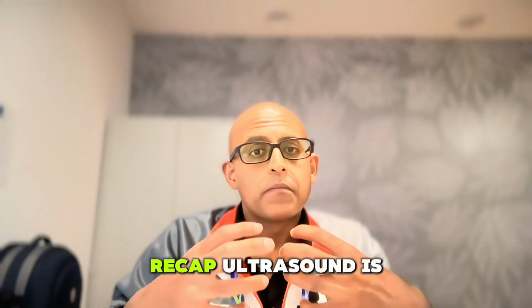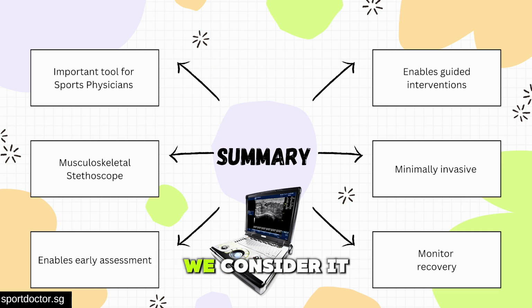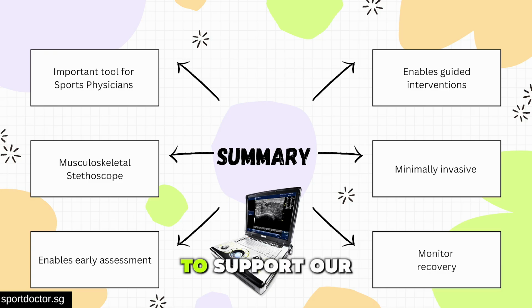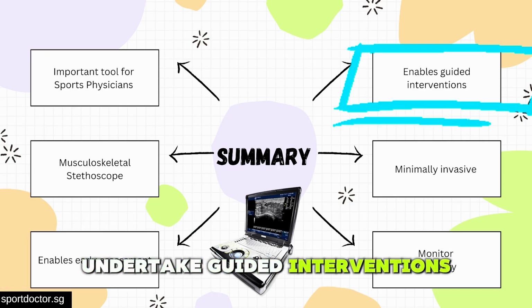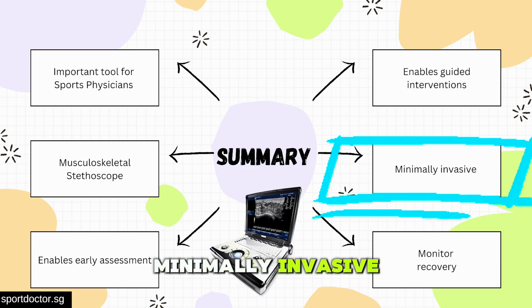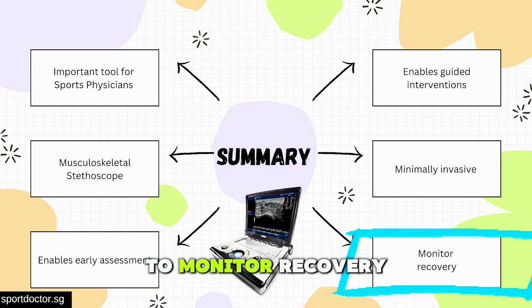So just to recap, ultrasound is an important tool for sports physicians. We consider it as our musculoskeletal stethoscope, and it allows us to support our clinical assessment of patients in a much more detailed and immediate way. It allows early assessment in the clinic setting, and it also enables us to undertake guided interventions. The advantage of it is that we keep things minimally invasive and we are much more focused in our approach, but also we can use ultrasound as a tool to monitor recovery.